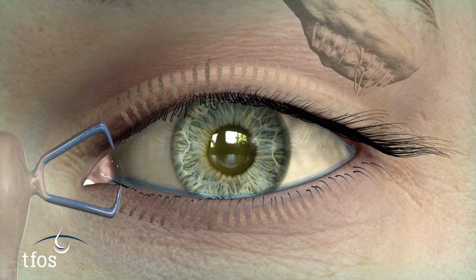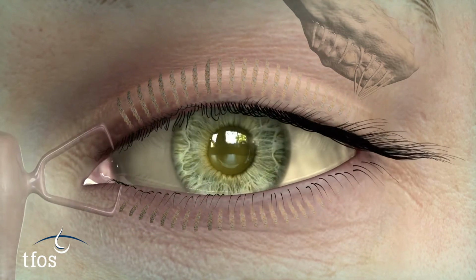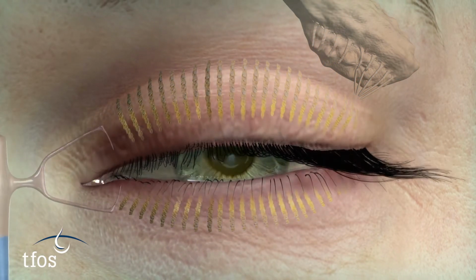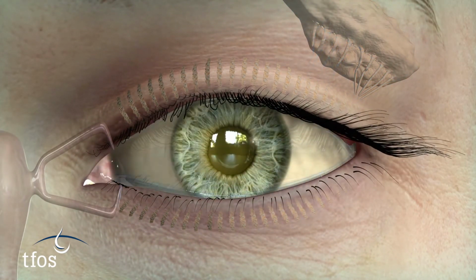The tear meniscus can be viewed non-invasively, so do not add fluorescein before performing this measurement. It is best to assess the meniscus height about 2 seconds after a blink, after the tears have stabilised, but before breakup has occurred and triggered reflex tearing.